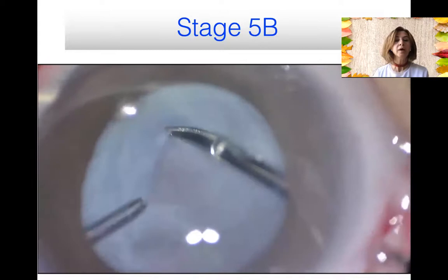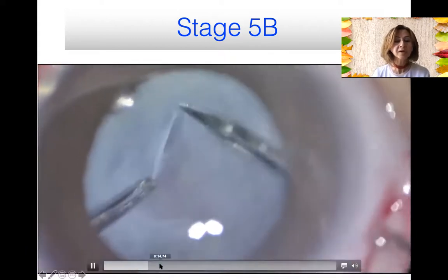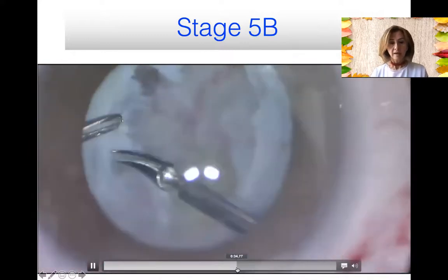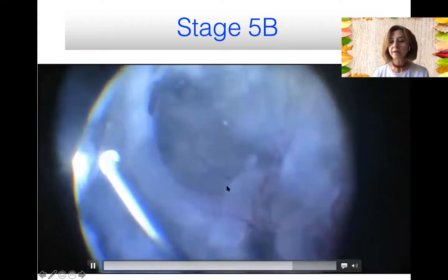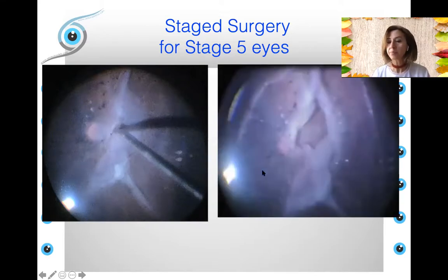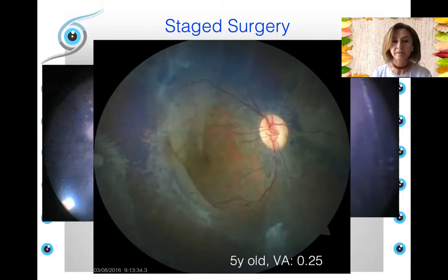What we do, we try to remove those membranes, dissect those membranes layer by layer with patience, very carefully. When you reach the retina and relieve the retina, it goes backwards. As you see here, we try to remove those membranes as much as possible, and you end up with something like this. And then you leave the eye in air, and then you can think about staged surgeries for these stage 5 eyes. As you see here, the retina goes backwards within months, and then you can do some more membrane removal, and it can end up like this. This was my best stage 5B case, with good vision, but that is sometimes what happens.